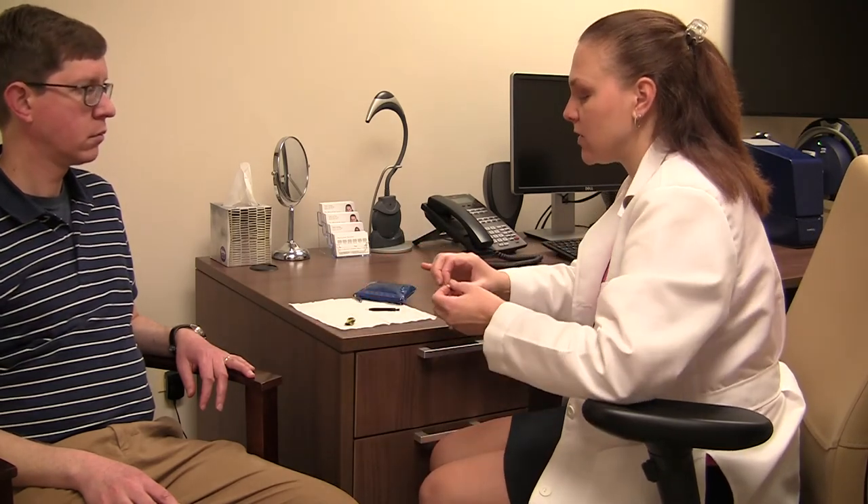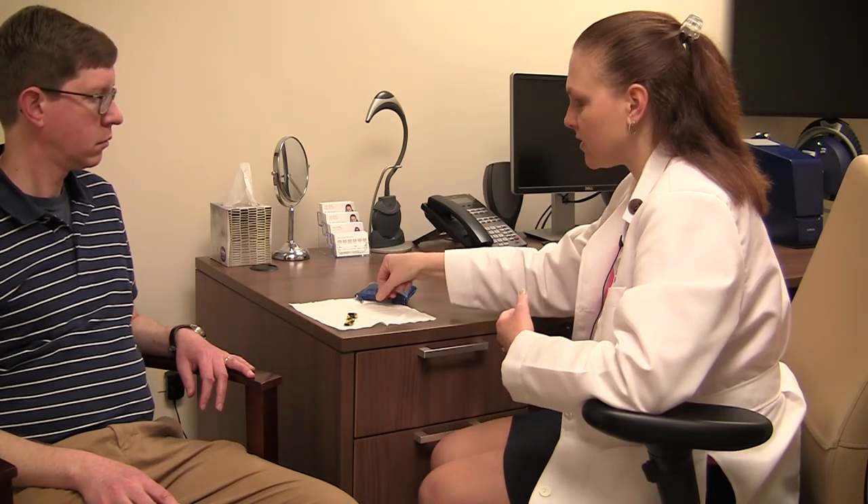They send you this little tiny cleaning tool. You're probably the only one who's going to be using these, so if you see any little bits of wax, dirt, or skin on them, a lot of times I'll just use a tissue because I can throw it away. You want to stay away from alcohols and hydrogen peroxide — anything that might eat away at the material. Soft and dry is really nice. If you feel like they're really dirty and need washing, you can use warm water and whatever gentle soap you use on your hands — Dove, Dial, Irish Spring — just a little bit of warm water, a little bit of soap, wipe them down, and let them air dry overnight before using them again.